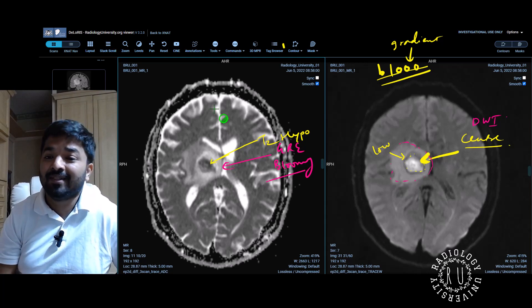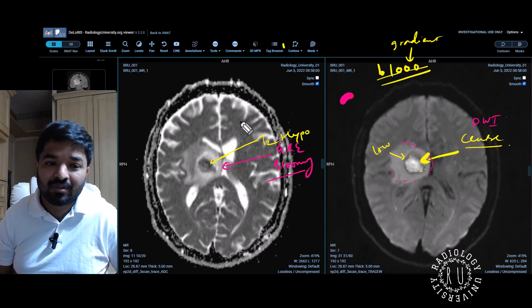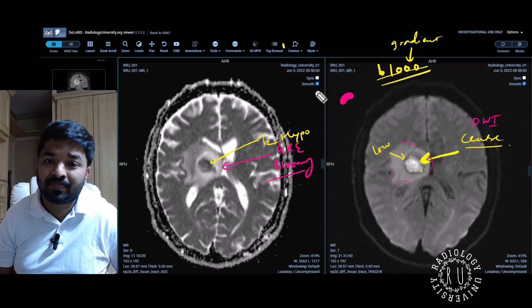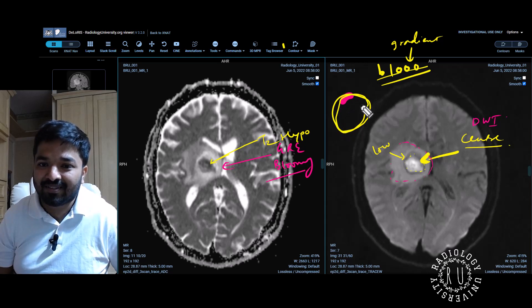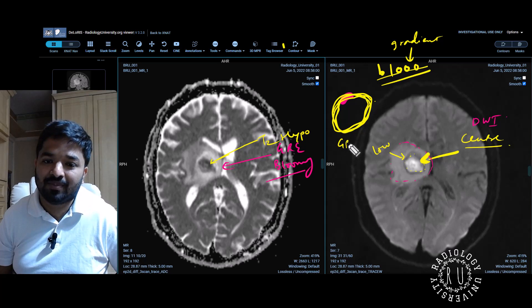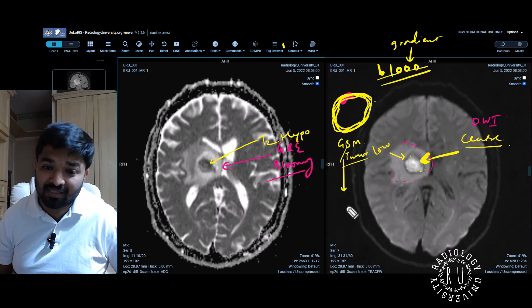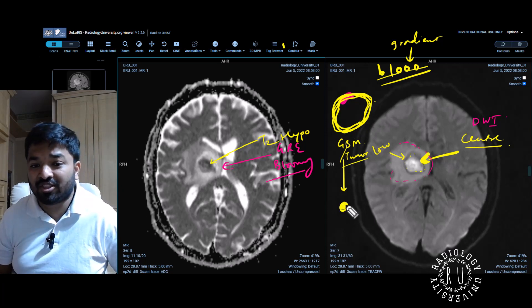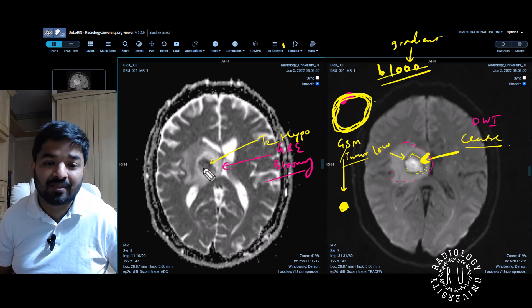Because if this were a tumor, it would show diffusion restriction in the periphery. If this is a tumor like a GBM, you have diffusion restriction in the periphery. It could be metastasis as well — both will show diffusion restriction in the periphery. If GBM or metastasis is small, it will show solid diffusion restriction. But it will not show this T2 hypointense rim around.